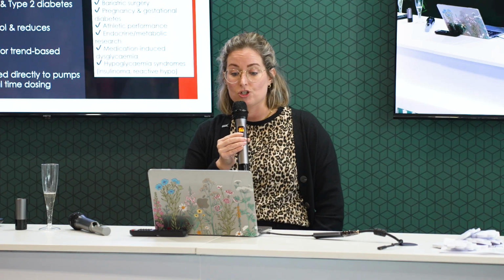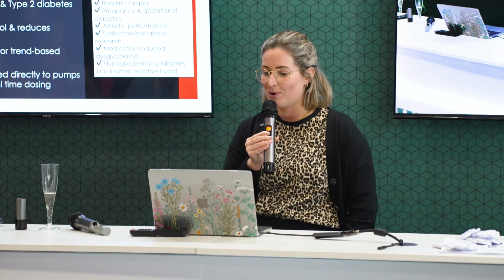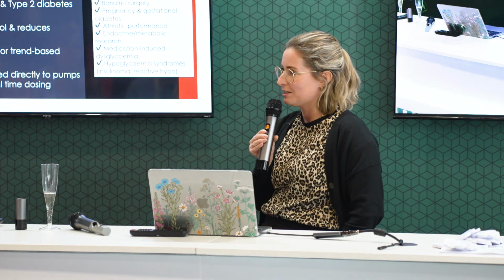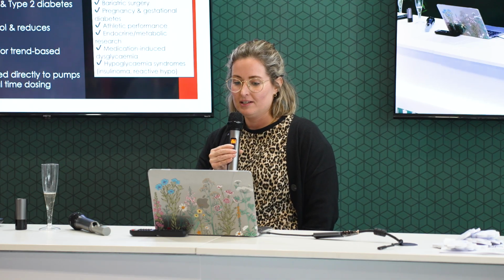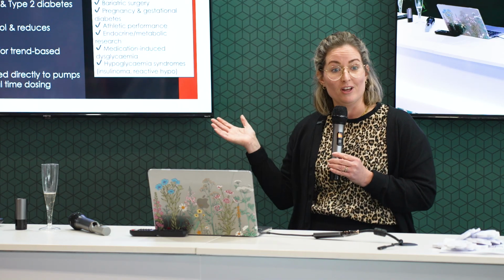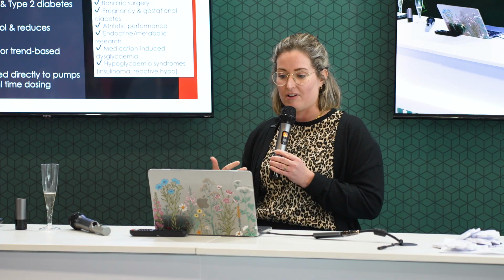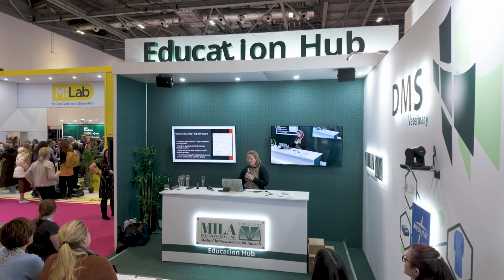Patients perhaps with pregnancy or gestational diabetes. We also now see these integrated into lifestyle, almost, blood glucose and interstitial glucose monitoring with people like athletes, or people who are trying to balance a nutritional way of managing their glucose. And again, any patients coming in where we're expecting to have an irregular glucose. So if we think about our veterinary patients, there's a whole group of patients in the hospital who would also benefit from the use of these devices as part of their monitoring and their management whilst they're in that hospital setting.